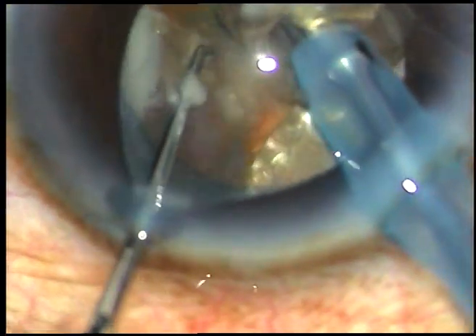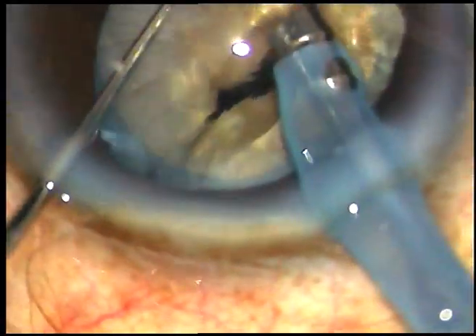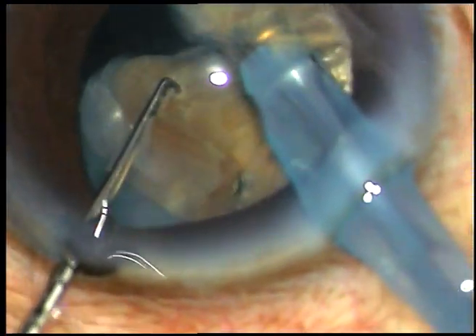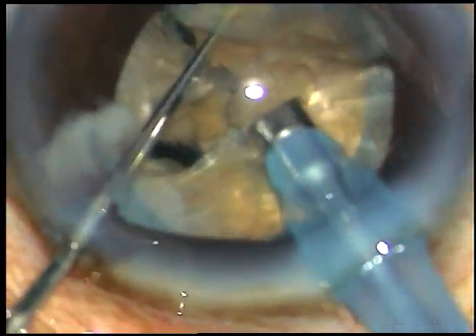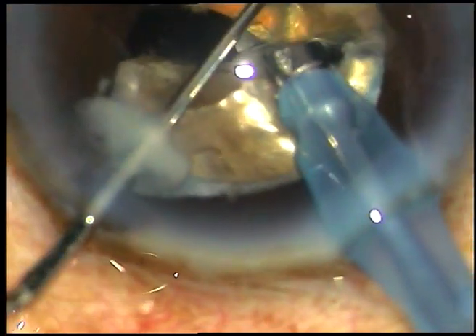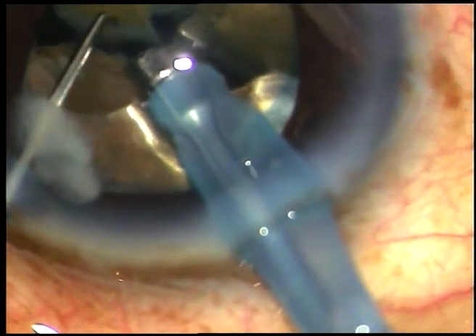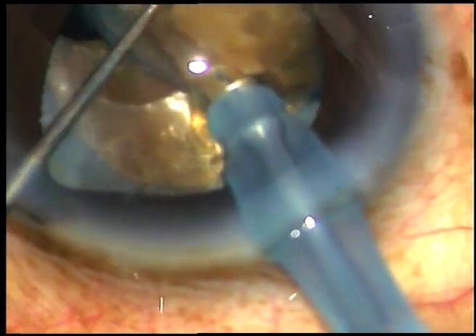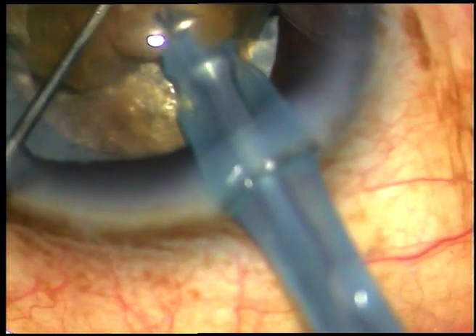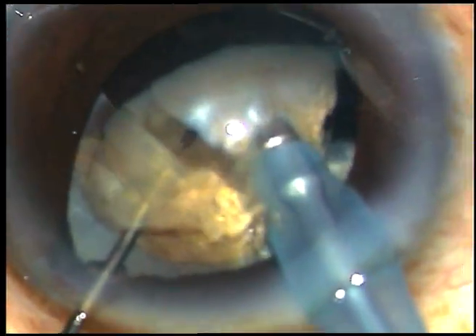Each hemi-nucleus is being chopped into two fragments. The anterior chamber is very stable, but a little bit of iris prolapse is being noted through the side port. The nucleus has now divided into four fragments, and I am going to emulsify each fragment. The phaco power used in this case is 80%, flow rate is 40 ml per minute, and vacuum is 420 mmHg.